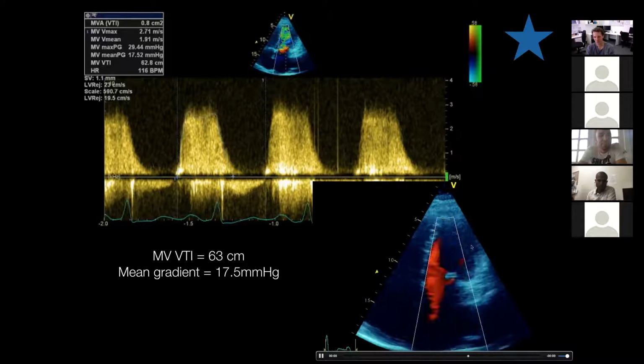I've got my flame jet, lots of variance coming through here in diastole, big left atrium, relatively normal functioning LV. Maybe a little bit of a bounce there during systole of the interventricular septum because of earlier contraction of the RV and an underfilled LV.